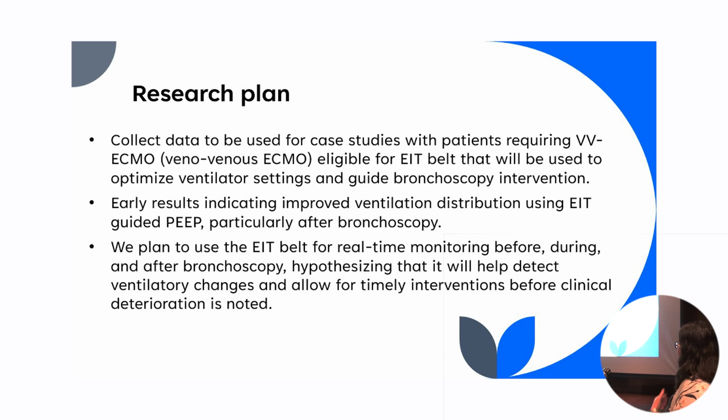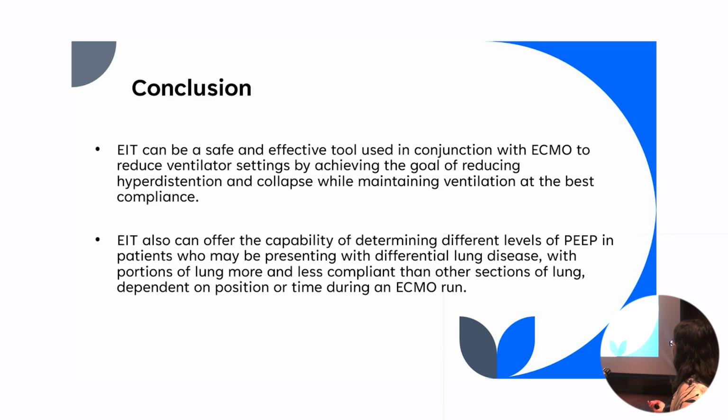Continuing our research plan, we're gonna continue to collect more data utilizing our EIT to see how we can optimize vent settings and possibly guide bronchoscopy intervention. And it has continued to show us how timely interventions can help us to keep a patient from deteriorating.